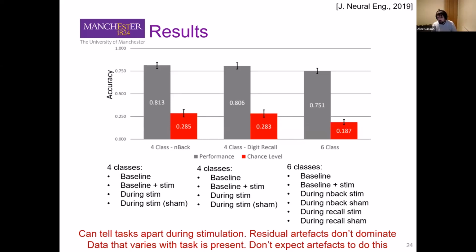With all of these things, we can't rule that out, but we don't see why the stimulator would be giving us different artifacts for the different tasks. We're not changing the EEG setup or the stimulator at all. We don't see physiologically why we'd be getting different artifacts for switching tasks. Again, the person is sitting at the same computer, with a very minor difference in the actual EEG task they've been given.